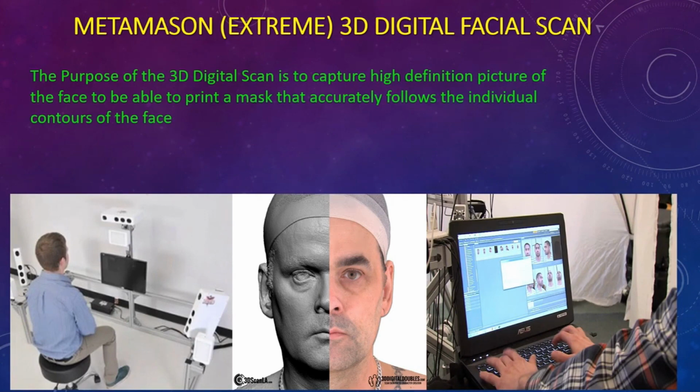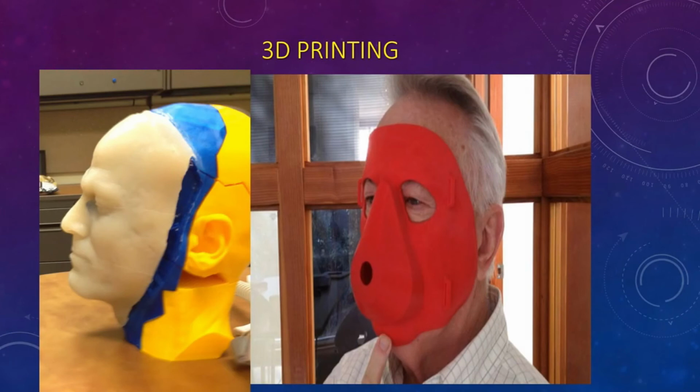Every contour is met. Because of the degree of resolution in their scan, they can easily construct a mask that is very custom fit to the patient's liking, or construct a very specialized mask that the patient might even enjoy, as shown in the picture above. Further, they can construct a cushion to fit an existing proprietary mask that is exactly molded to their face.